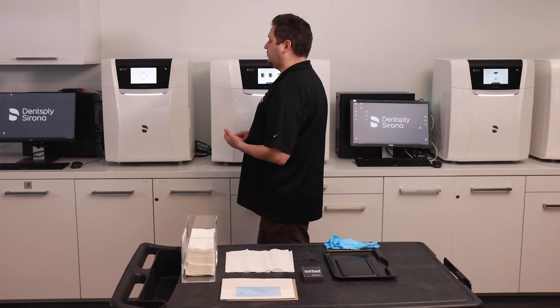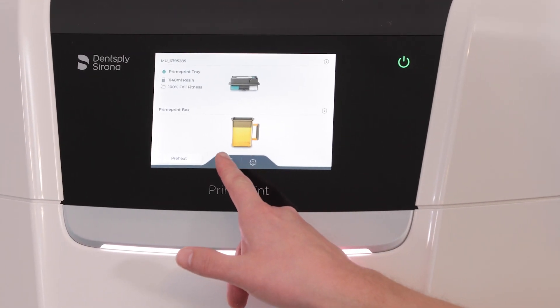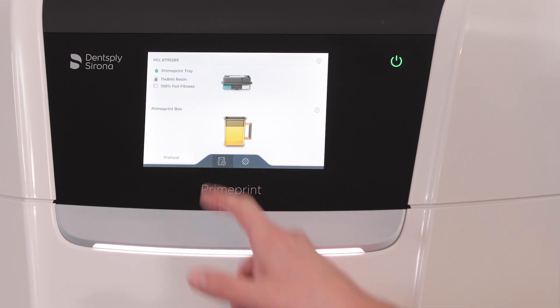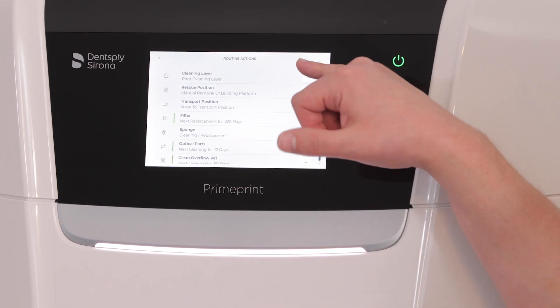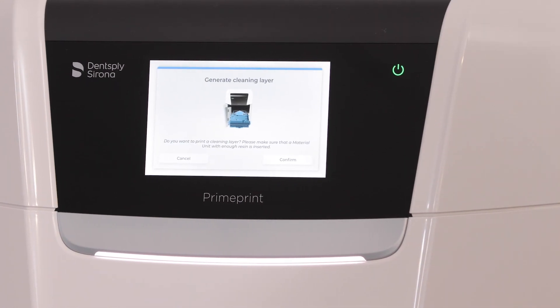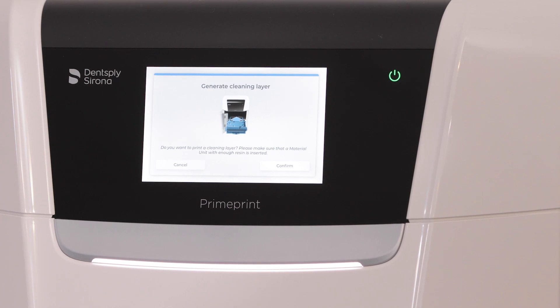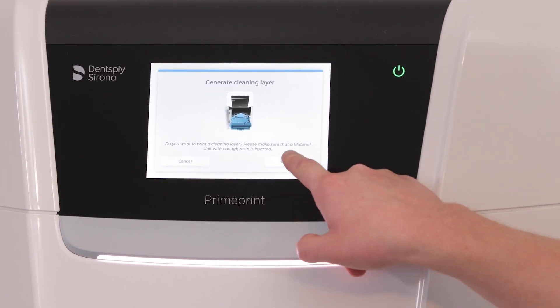Once it reads the RFID from the cartridge and the material unit, it's going to bring me back to the main screen. I push the routine actions button, which looks like a printer, and right at the top there is the cleaning layer option. I select that. It asks: do you want to print a cleaning layer? Please make sure there's enough resin in the material unit. And I confirm.